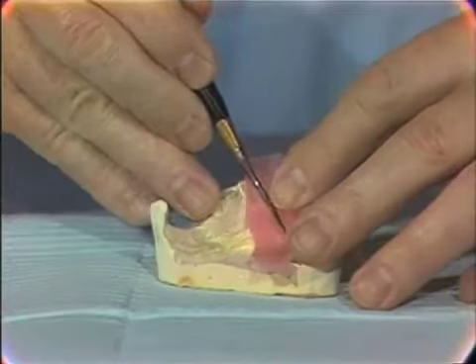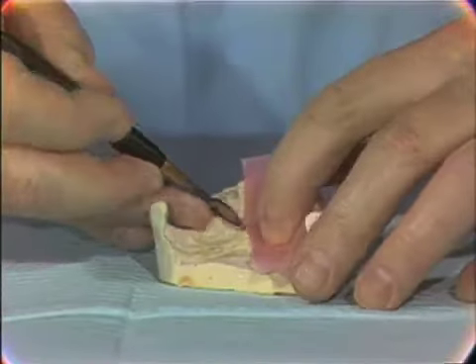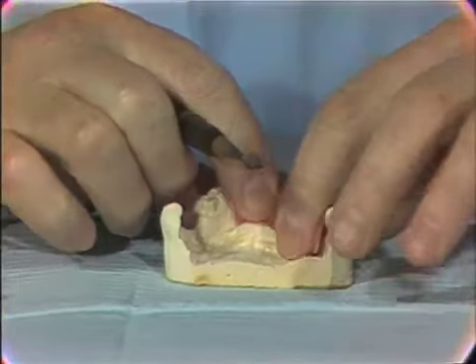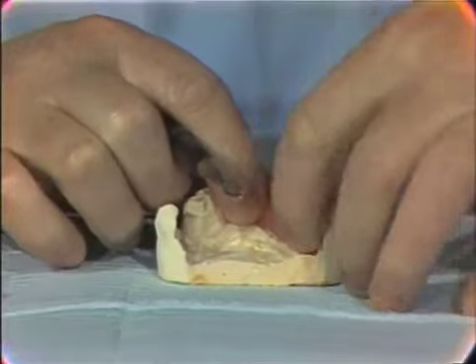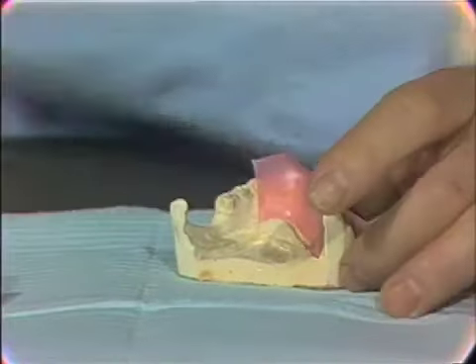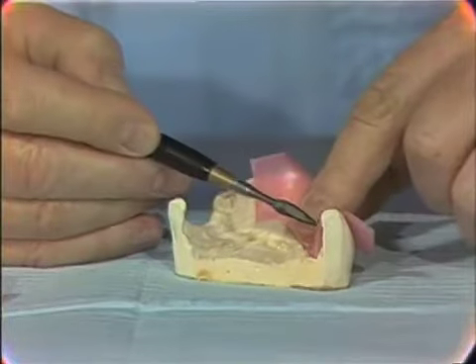Now, the question continually comes up as to how much relief you should have under the tray. If you want to work with a relief, one thickness of the pink base plate wax that hasn't been thinned out too much would be an adequate relief.